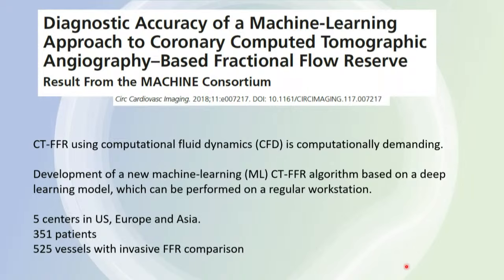And here is one study looking at one algorithm that has come up with this machine learning-based CT-FFR. So the argument is that the CT-FFR using computational fluid dynamics is computationally demanding. It has to go to HeartFlow. It has to come back to us. And these newer versions of CT-FFR, which are based purely on three-dimensional anatomy, can be done on your desktop with the click of a button on just a regular workstation.